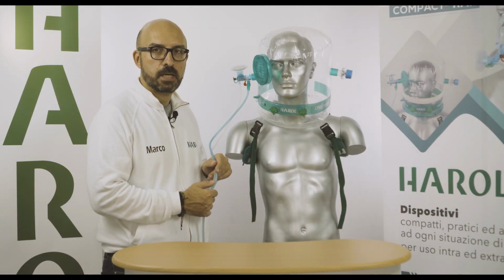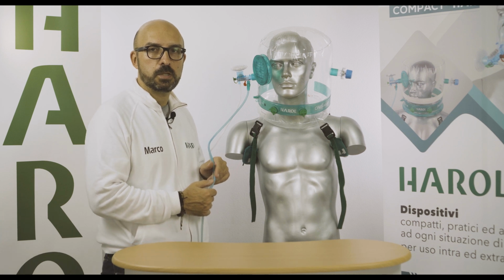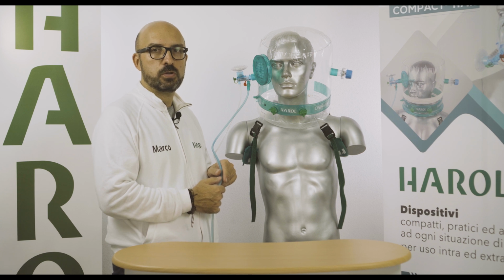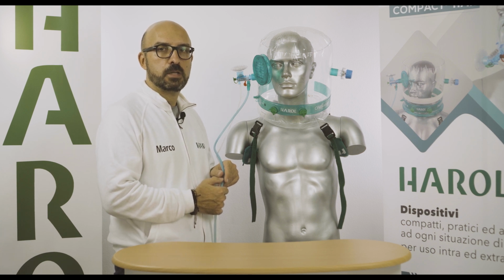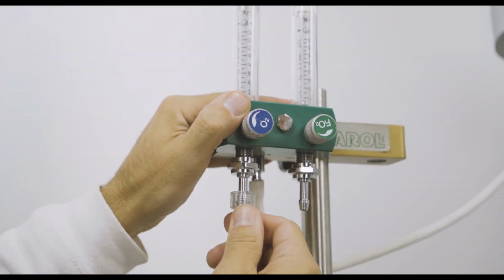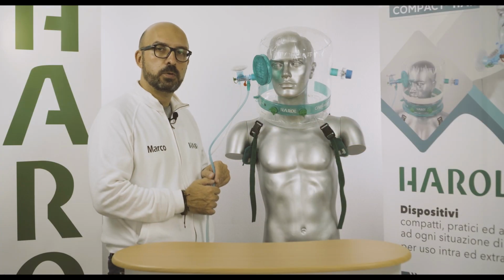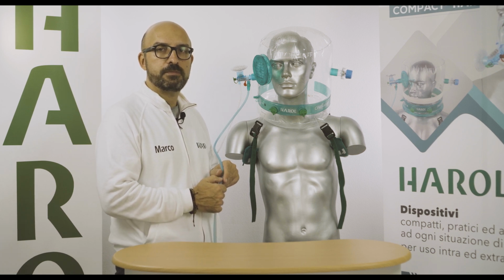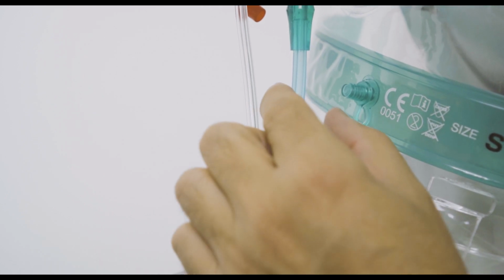This helmet is particularly useful in emergency departments, and in all those departments where the high-flow CPAP generator is not available. In fact, for operation, it is sufficient to use an oxygen flow meter of at least 15 liters per minute. Even if, as we will see later in the video, it is preferable to have at least 2 flow meters to be connected to the 2 input lines of the compact Venturi.